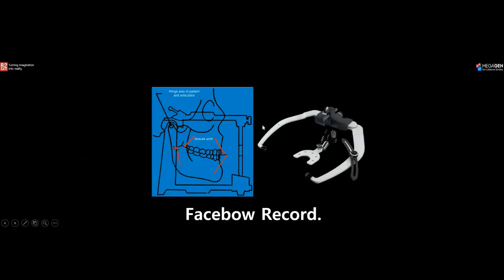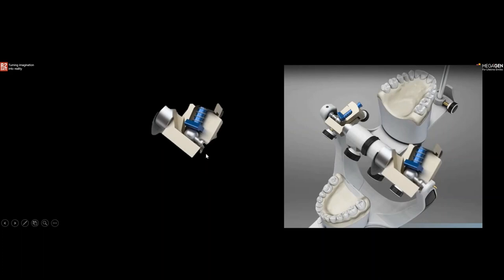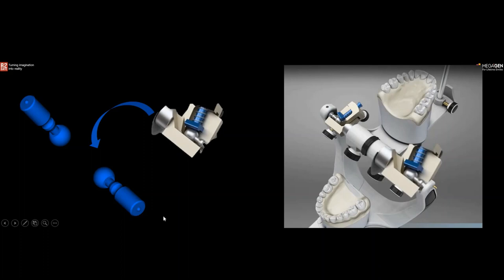A face bow is a device used to match the hinge axis of the patient to the hinge axis of the articulator. The patient's hinge axis is the condyle; the articulator's hinge axis is its corresponding component. In R2Gate software, this part of the articulator has been digitized, and we match it to the condyle of the patient.